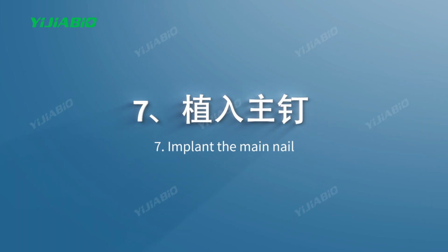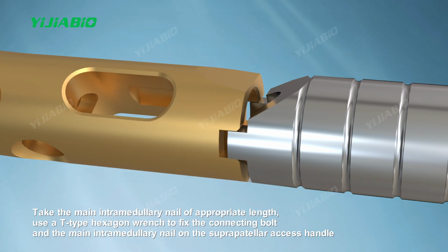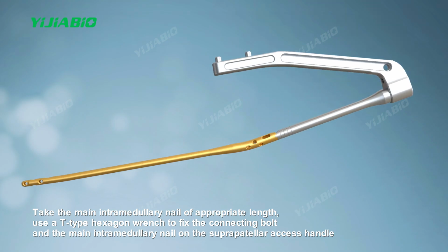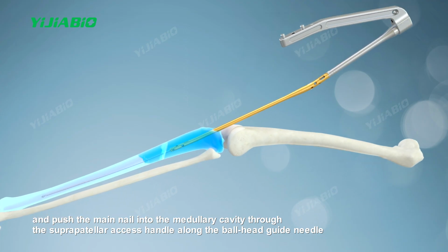Seven, implant the main nail. Take the main intramedullary nail of appropriate length. Use a T-type hexagon wrench to fix the connecting bolt and the main intramedullary nail on the suprapatellar access handle, and push the main nail into the medullary cavity through the suprapatellar access handle along the ball head guide needle.